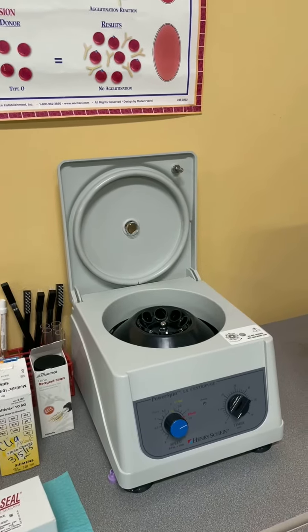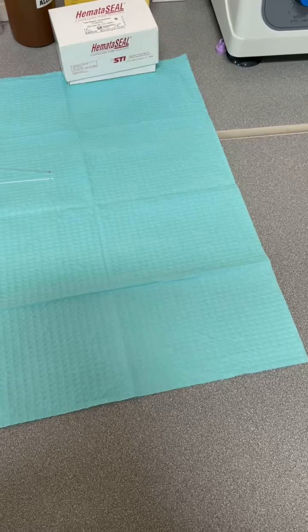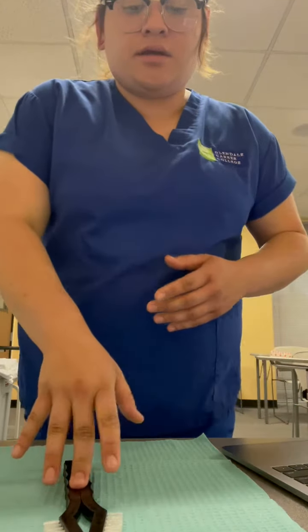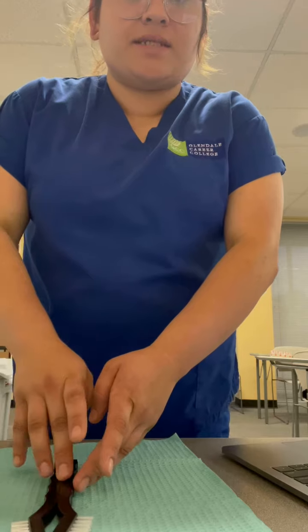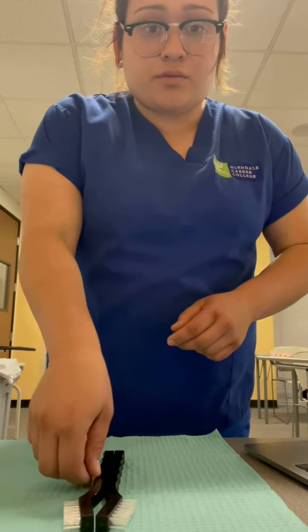Other than the autoclave supplies, we're going to need our autoclave paper. We're going to need our pouches to put our clean supplies in. We're going to use our steam indicator strip to put inside. It's going to tell us that our supplies got to the temperature that they needed. The indicator strip is put inside to make sure that our supplies that were cleaned reach the temperature in order to be sanitized and sterile. So we're going to place the strip inside with the supplies.